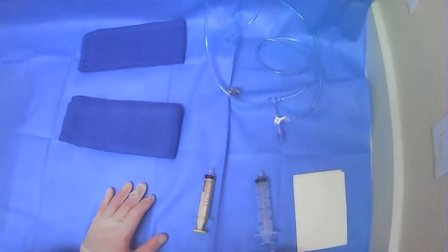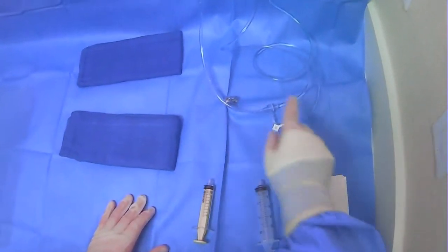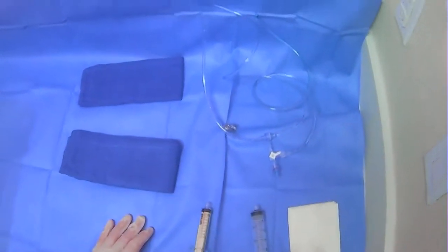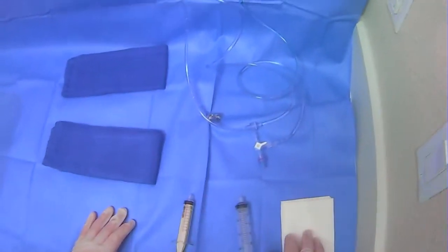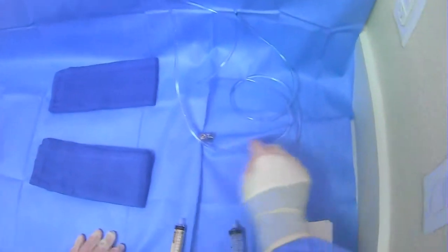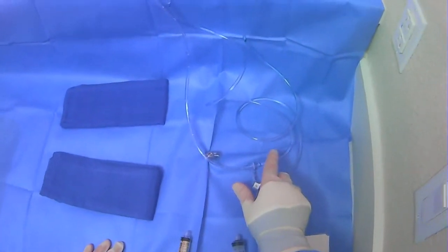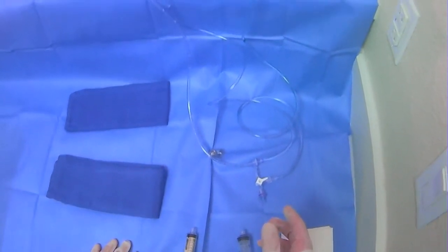Most basic trays that you start off with will have this apparatus that's used to fill saline and contrast quickly. Essentially, this device has a line for drawing — this one is normally saline. If there's ever any confusion, you can trace the tubing back to see where it's going. You'll see a saline bag hanging off the edge of the table you're working upon.